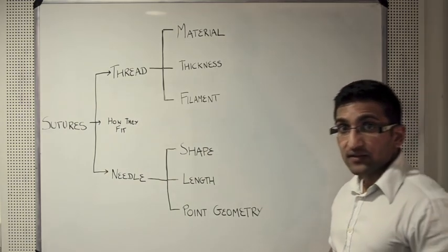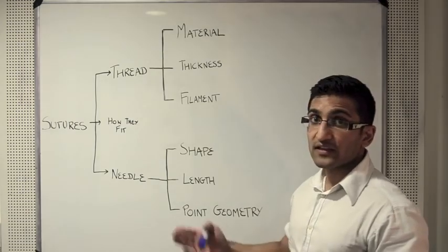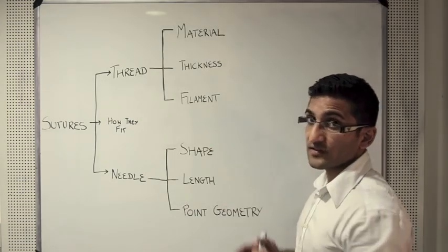Starting off thinking about the thread. As most people are taught about in medical school, you can think about a thread in terms of the material, the thickness, and the composition in terms of the filaments.